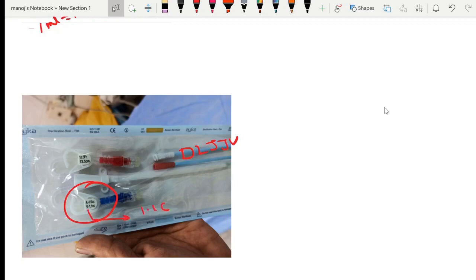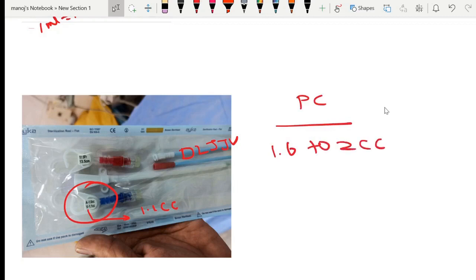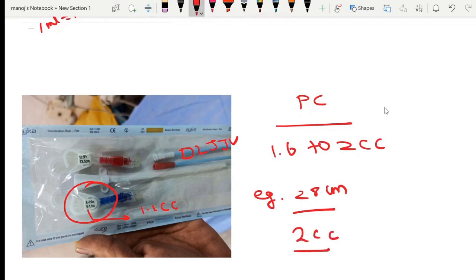In permacath, it usually ranges from 1.6 to 2 cc. For example, in a 28 centimeter permacath, the arterial priming volume and the venous priming volume is 2 cc. So from the final 5 ml of gentamicin solution that we prepared, 2 cc is put in the arterial line and 2 cc is put into the venous line.